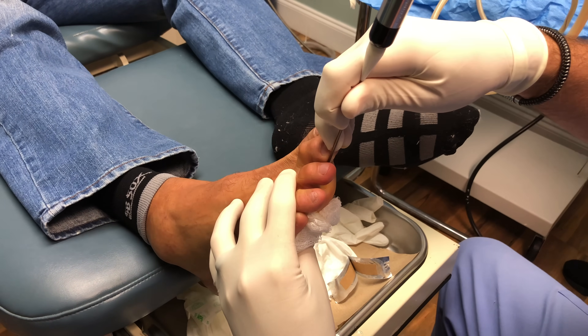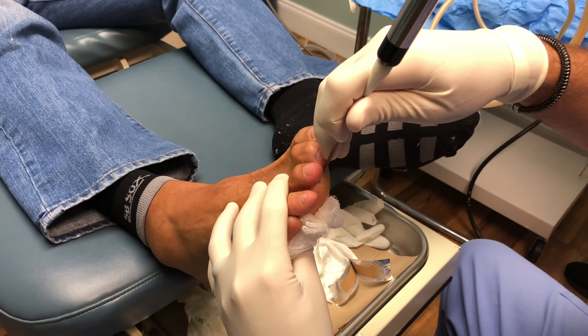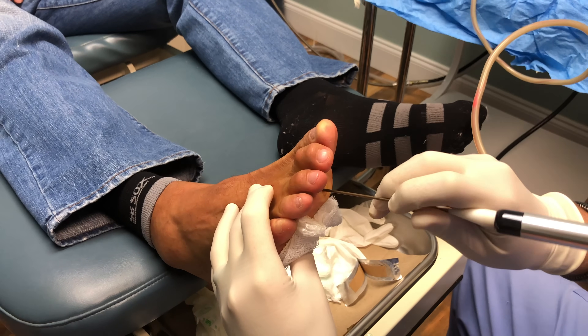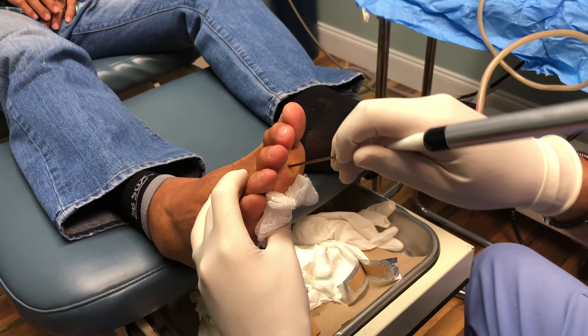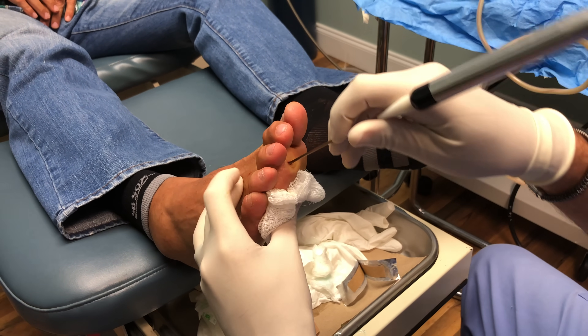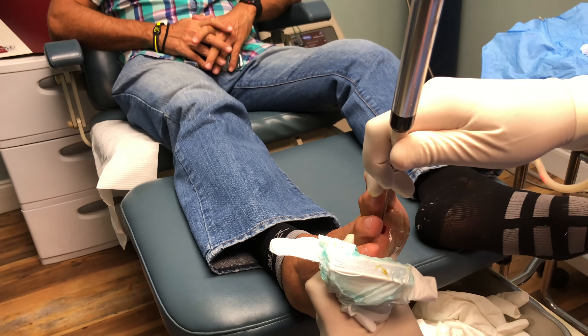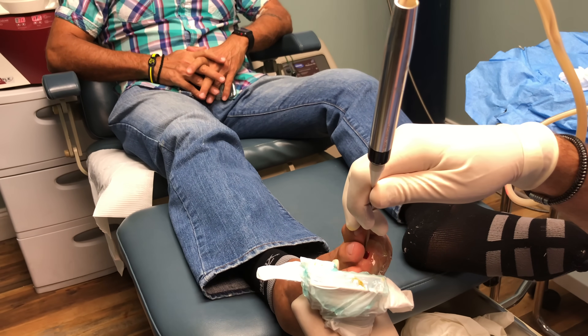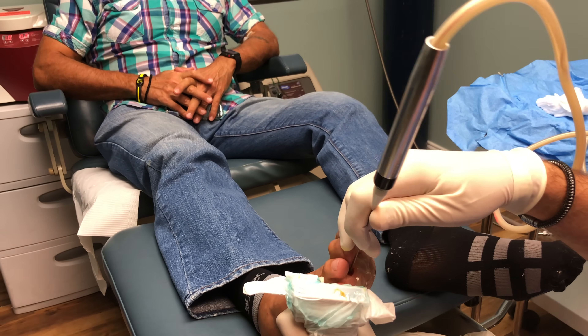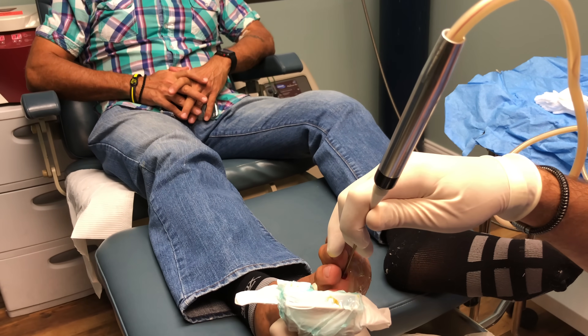You're going to kind of give. And now we're into that tissue and we pull up. You're going to see how those two toes go down — that lets me know that I'm underneath that transverse intermetatarsal ligament, which is kind of where that nerve is. So we're at the two-minute freezing cycle. Basically we just hold the probe here, we visualize it. I like to spend some time with the ultrasound to make sure we're in the right spot.